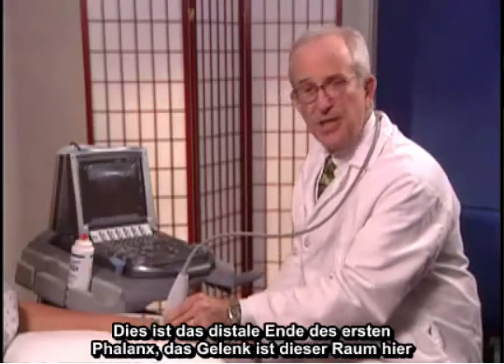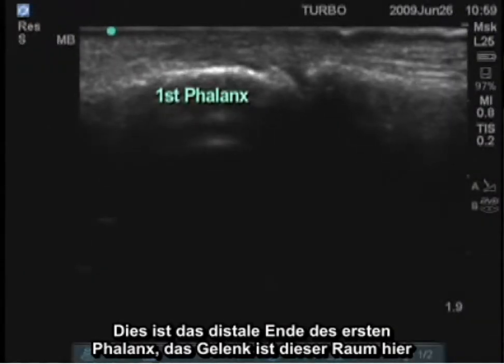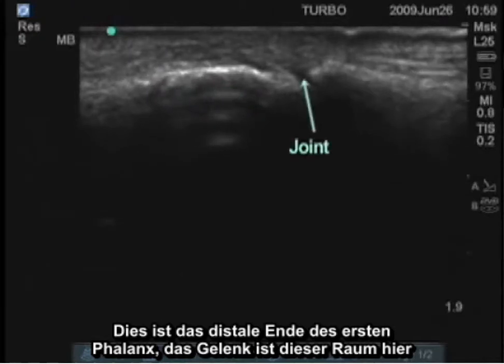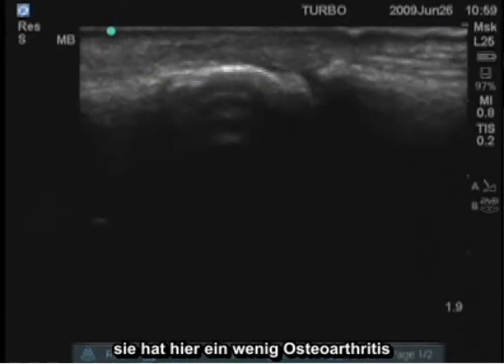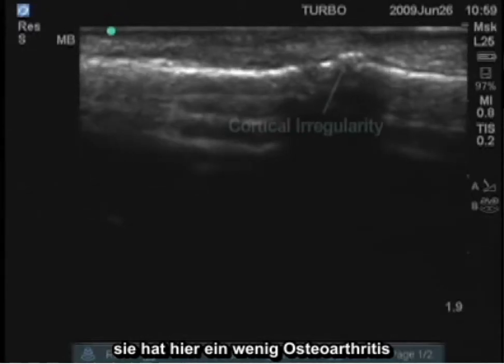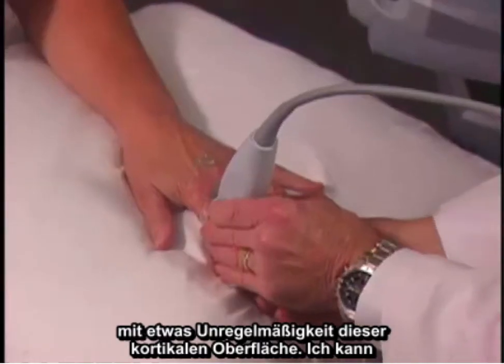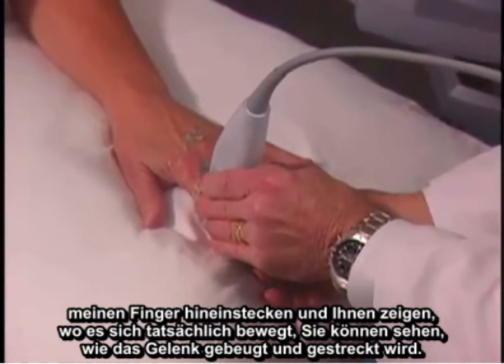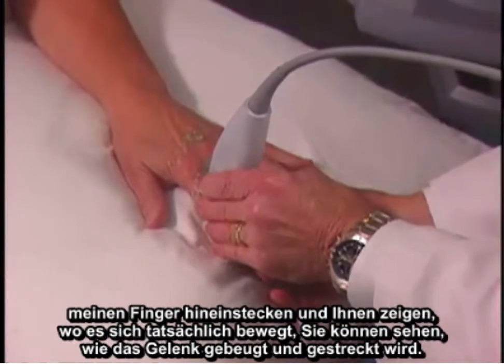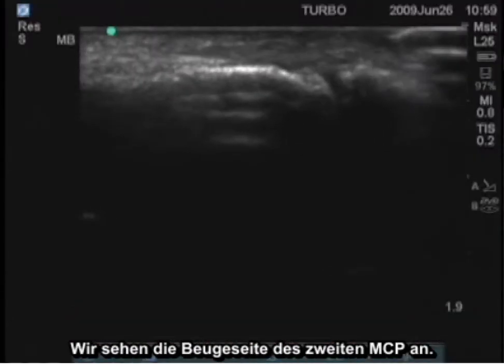We'll look at the PIP. This is the distal end of the first phalanx; the joint is this space here. She happens to have a small amount of osteoarthritis here with some irregularity of this cortical surface. I can slip my finger in here and show you where this is actually moving — you can see that joint flexing and extending.